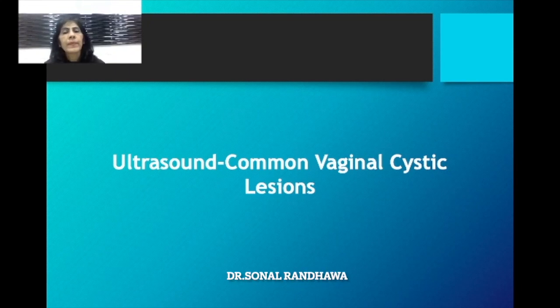Hello everyone. Today's CME we will be talking about vaginal cystic lesions, as I had promised you. I'm not going to cover all the vaginal masses. We'll just talk about four common cystic lesions that we come across while doing a vaginal scan.